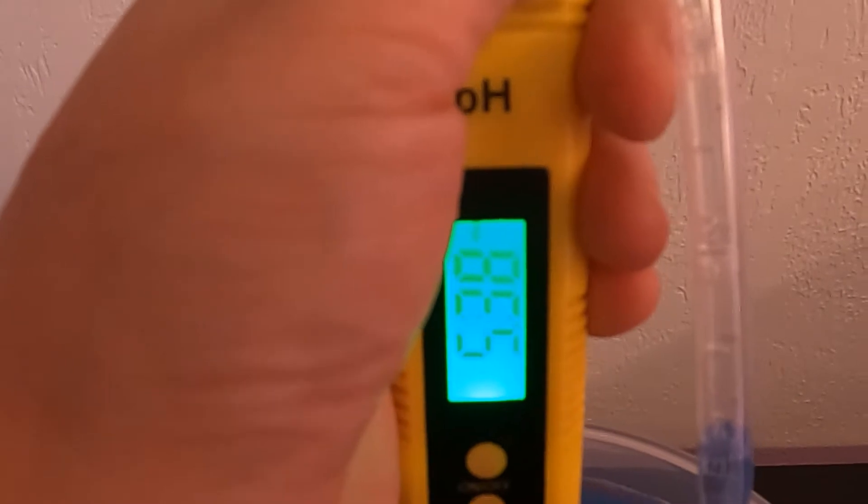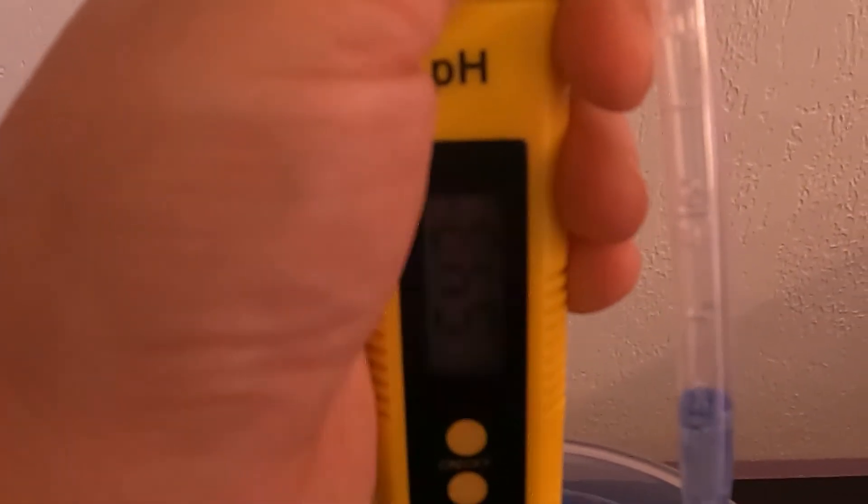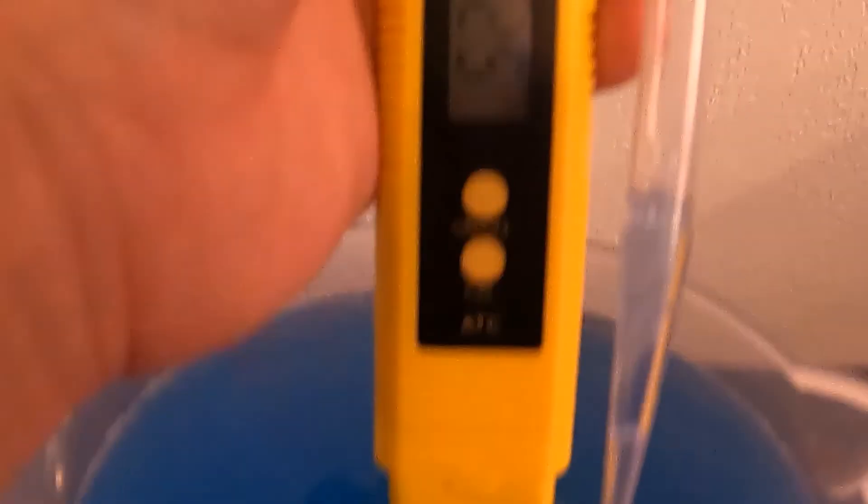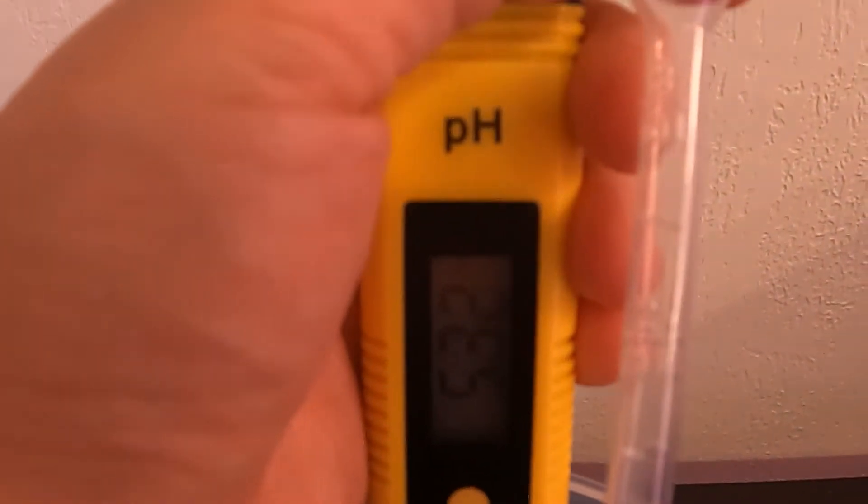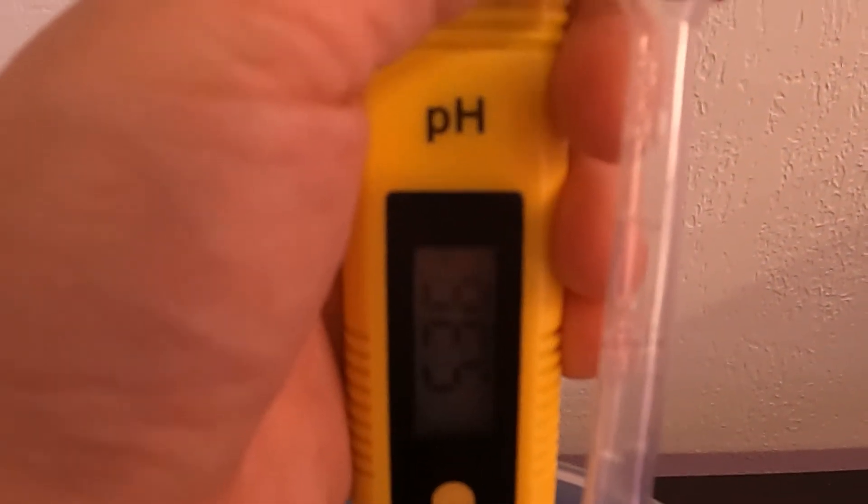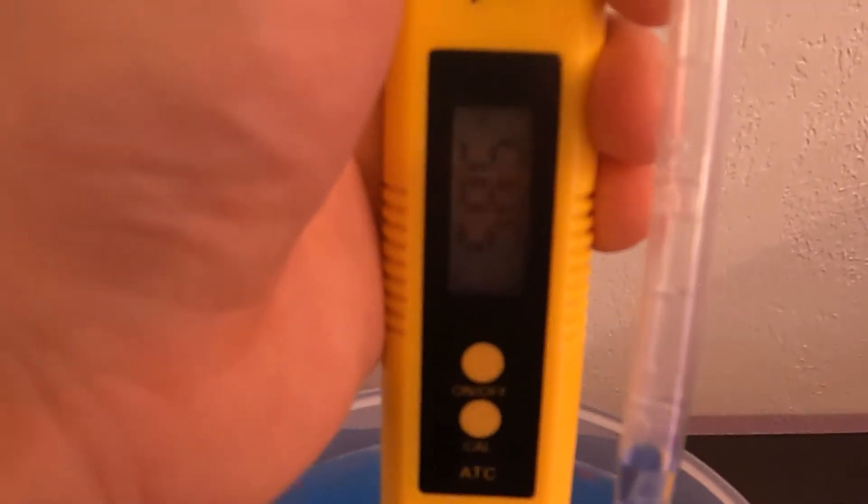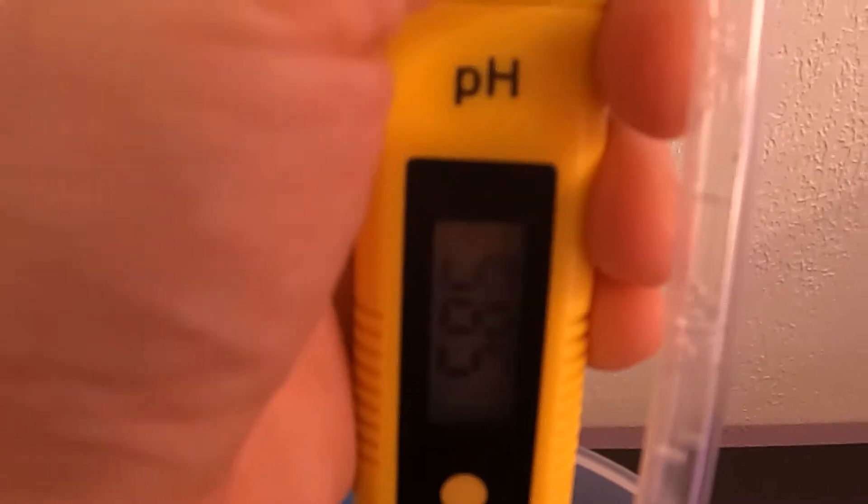You want to make sure you're adding your pH up slowly because it jumps quickly as you can see. A little drop at a time. We're currently at 5.85 and that's good enough for me. So we'll go ahead and rinse our pH meter and put it away for next time.